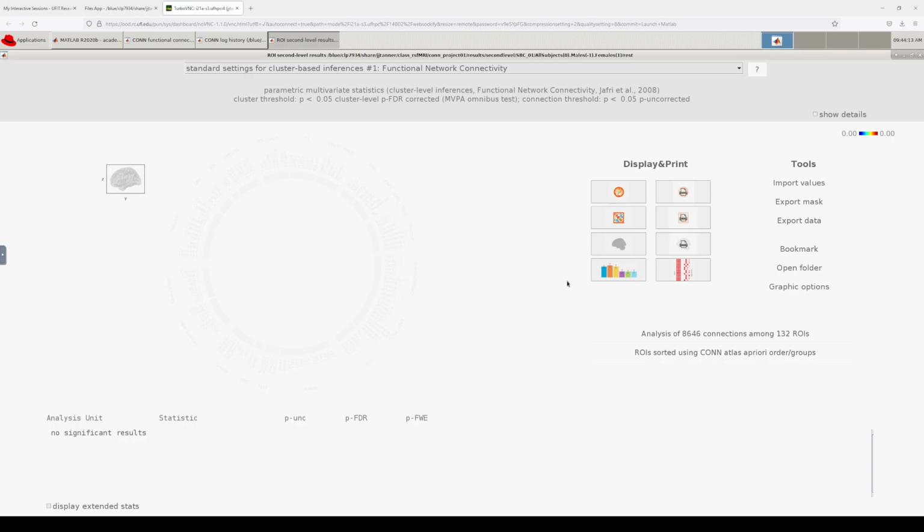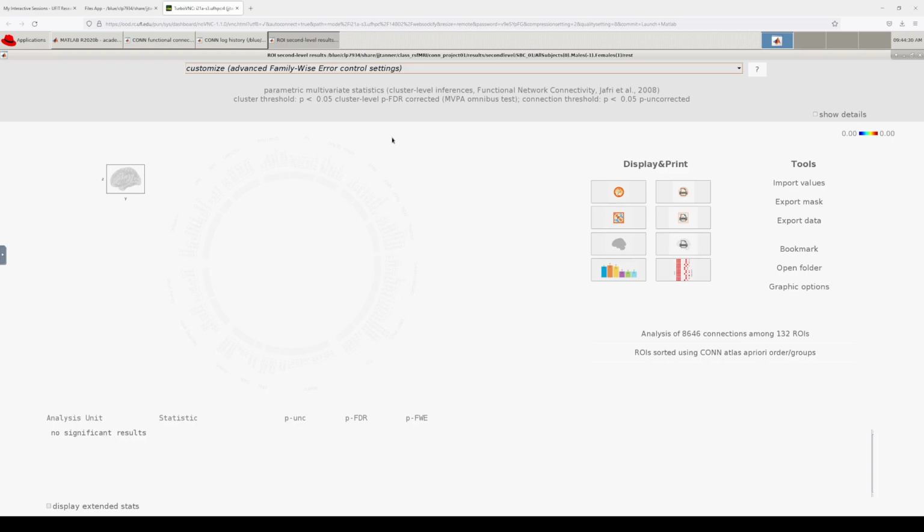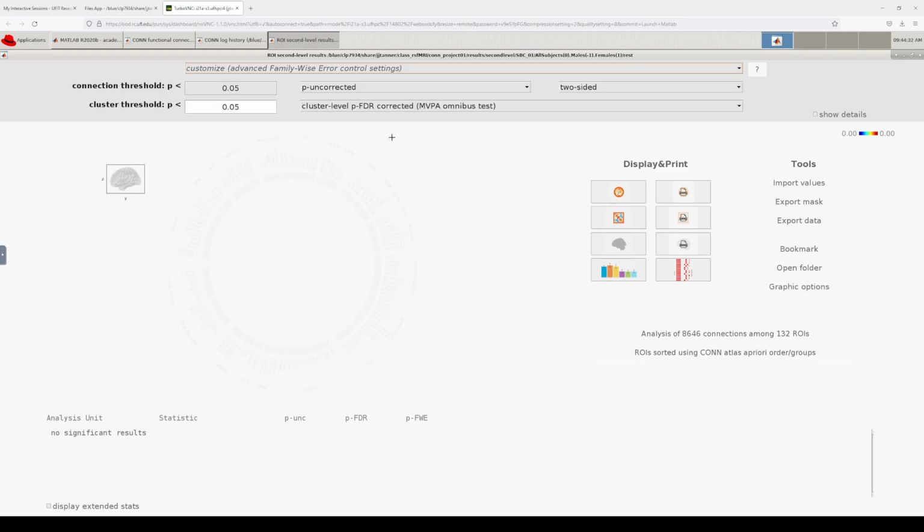But that means now we're only testing about 16 to 18 versus 24 or so, and that's not a lot of people in each group. So we are underpowered for the analyses. And that's where we might be a little bit more or less stringent with some of our statistical analyses. Again, that's a different question.